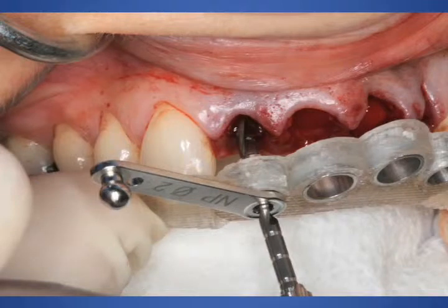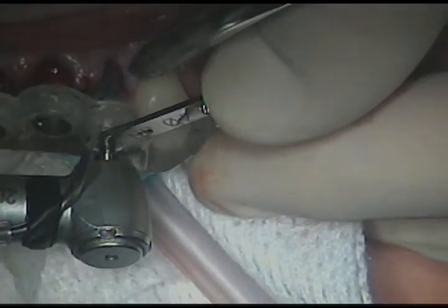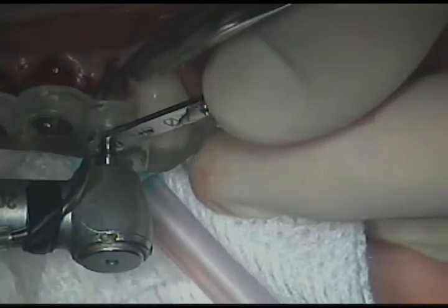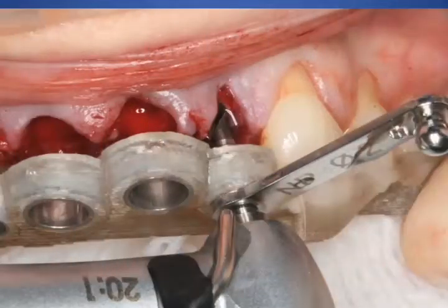You can see that the initiating drill, or the pilot drill, has markings on it. We know we're going to a certain depth, 13 millimeters, and we'll go to the proper line. Here we'll show a video illustrating the pilot drill simply drilling to the stop that's created in the drill itself. We go to depth and stop.